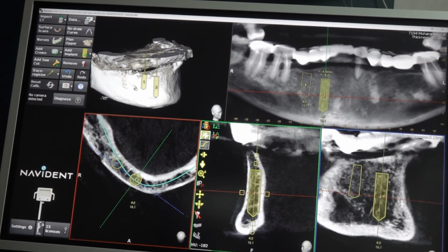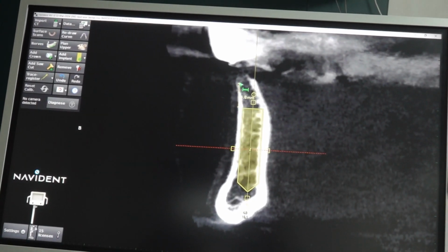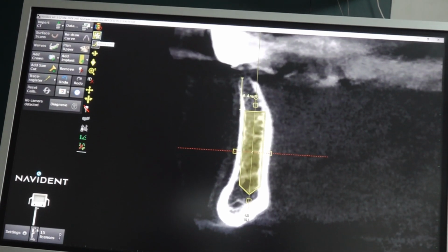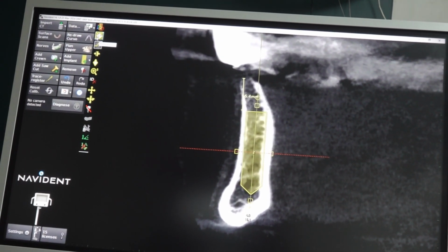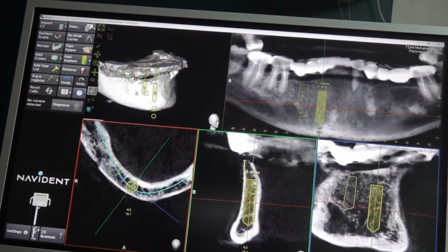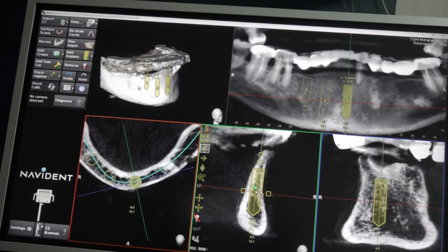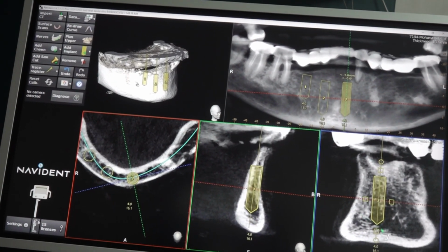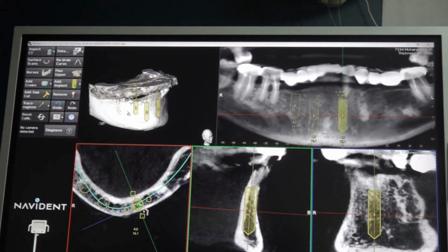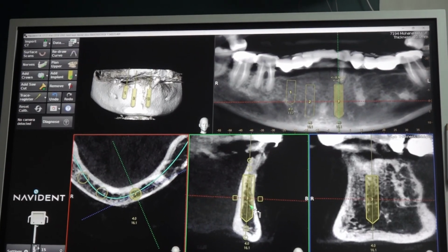This much amount we will measure. From 6 mm alveoloplasty, even after 6 mm alveoloplasty we can place a 16 mm. Okay. Here also it is very thin bone. Very thin bone.